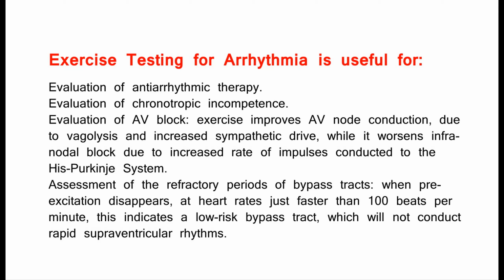Assessment of the refractory periods of bypass tracts: when pre-excitation disappears at heart rates just faster than 100 beats per minute, this indicates a low-risk bypass tract, which will not conduct rapid supraventricular rhythms.